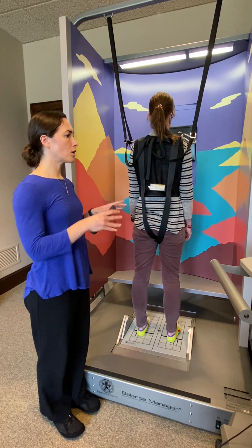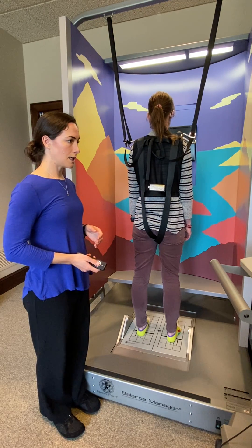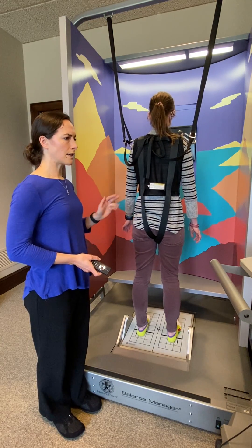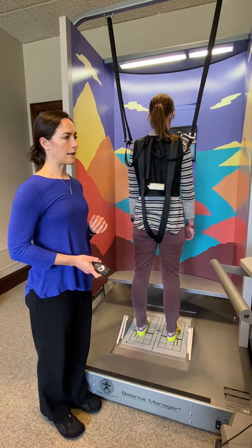We'll first show toes-up adaptation testing. Jill, are you ready? Ready. I'll begin the test starting now. Good, I'll stop the test. Normally we would do five of those toes-up trials. Next we'll show toes-down.